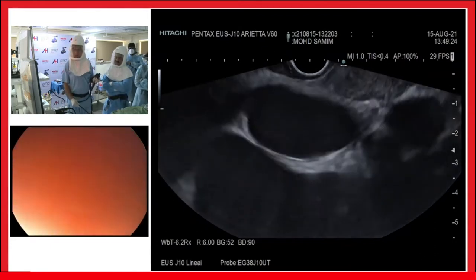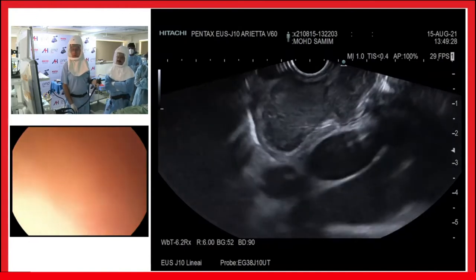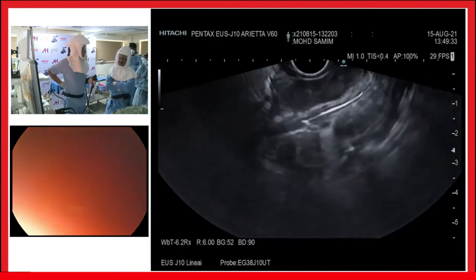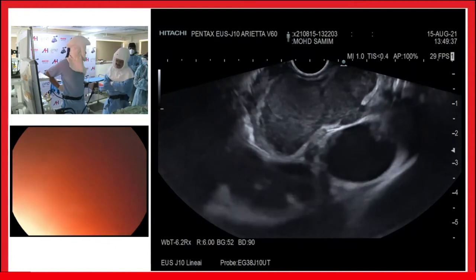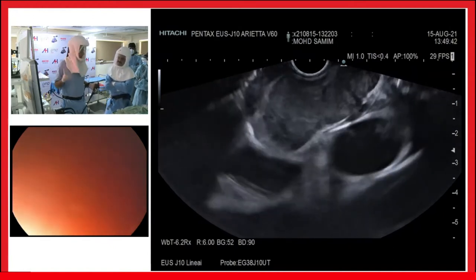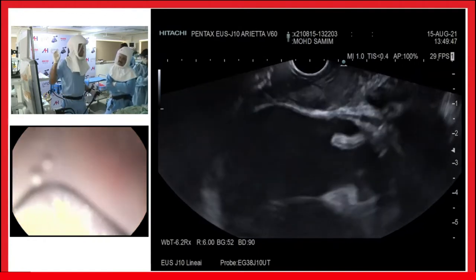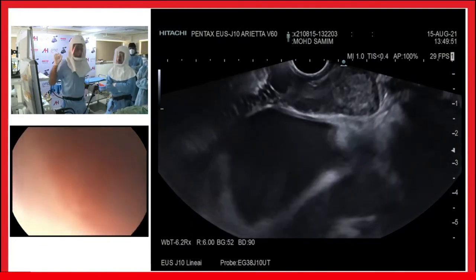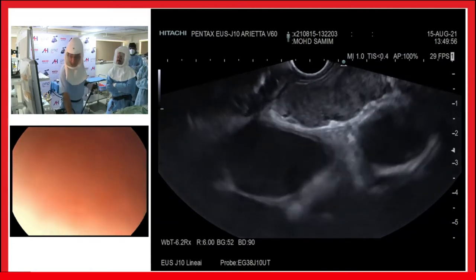First, let us characterize these nodes. These nodes, what we are seeing here, are more or less pathological nodes. We will take the FNAC later in this case in a separate chamber, because we have one more case to go. Our job was to demonstrate that this is a case of tumor involving the lung with extension, and if by chance extension into this, you can take an FNAC.